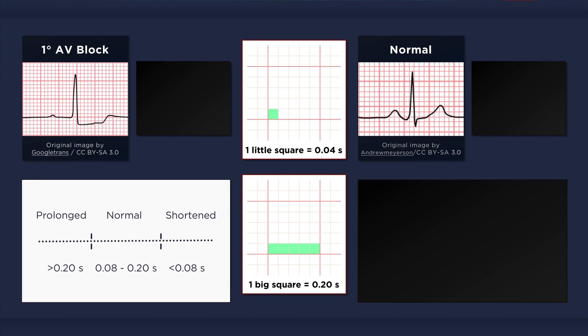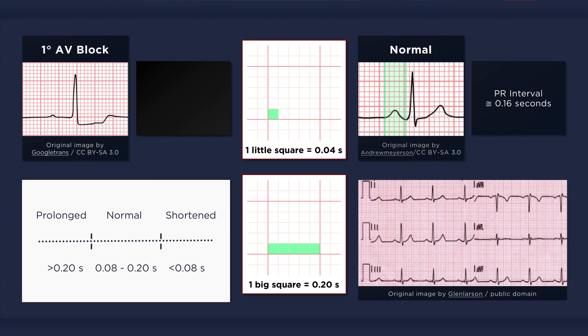Now let's count the number of small squares within the PR interval in the normal ECG at the top right corner of the screen. There are about 4 little squares. That equates to 0.16 seconds, which is well within the normal limits. Now let's look at the image below. The entire PR interval fits within one big square, so even without calculating it, we already know that it's less than 0.2 seconds, and thus it's not prolonged.